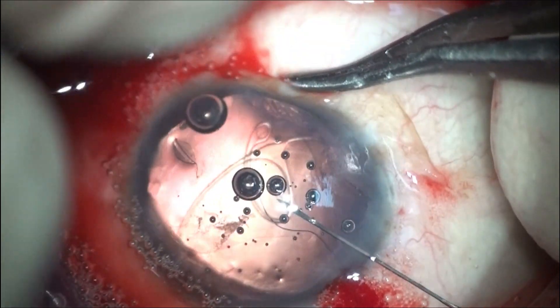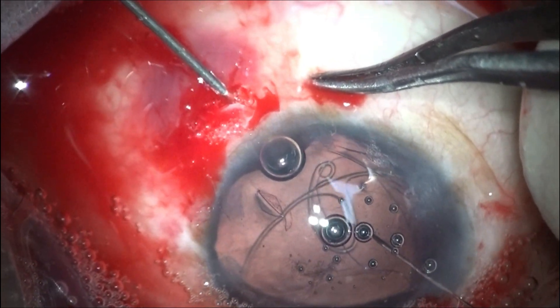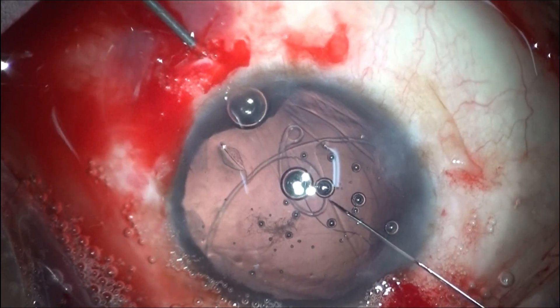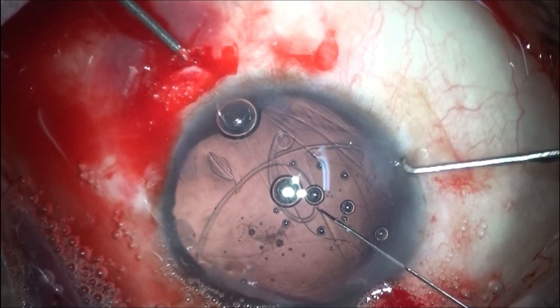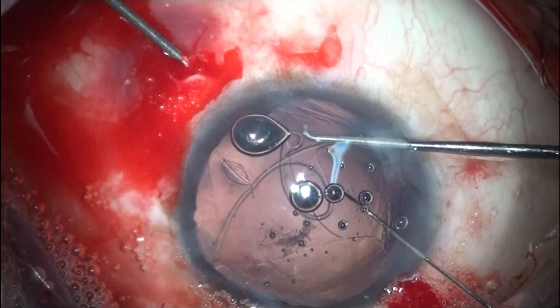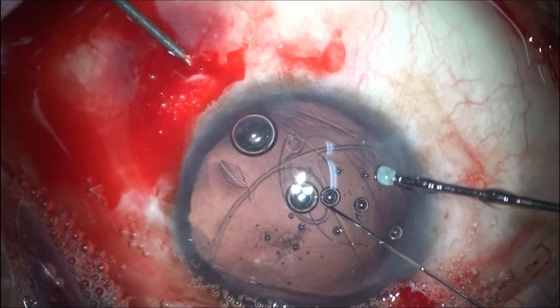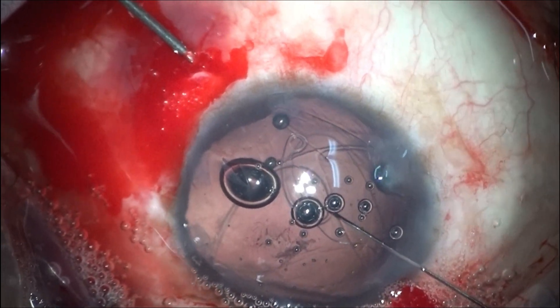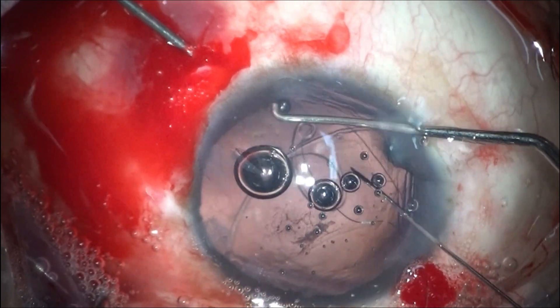I am trying to insert a 26 gauge needle so that I can railroad the prolene suture. The difficulty I am facing is that the needle is going into the iris and in that area the visibility is less. I will be putting some viscoelastic and trying to judge the level of the needle — whether it is anterior or posterior to the iris — and then inserting the needle further. Remember the tips mentioned earlier: push OVD to make some space between the bag and the iris, and make sure that the needle is not coming anterior to the iris. Particularly in these cases where the iris is atrophic, you may miss and push the needle anterior to the iris.